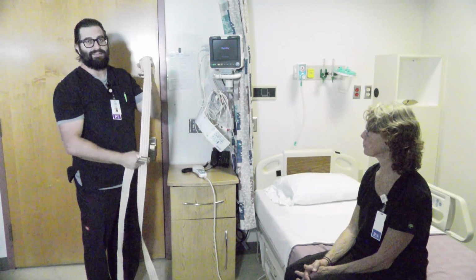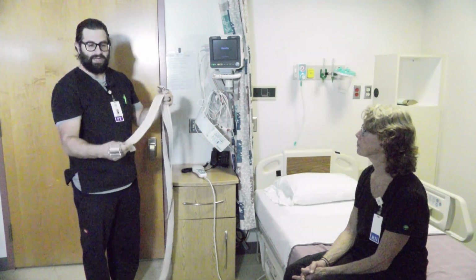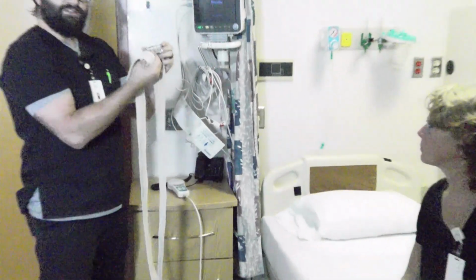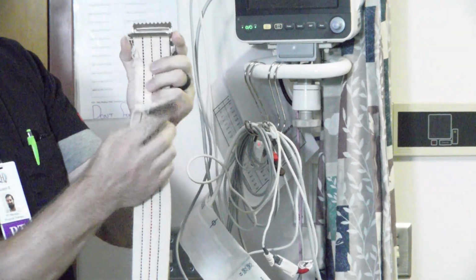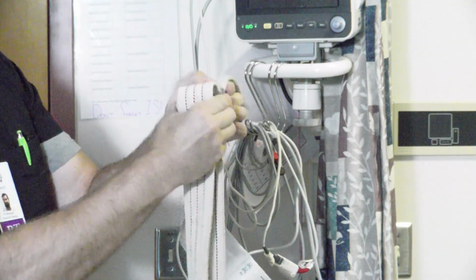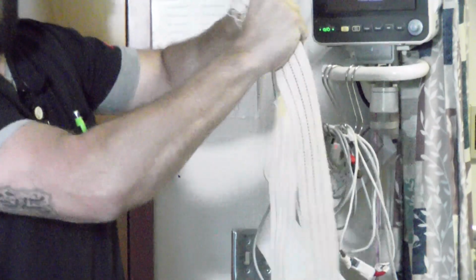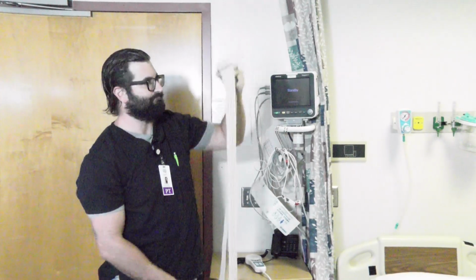But if you don't have access to that, you can use two different gait belts to make a bigger one. And so what it looks like is this. You see the T side of the belt, okay? You simply take the opposite belt and you stick it through and then through the hinge part of the belt. Okay, and that creates a very strong, tight pull. I cannot pull that out, okay? And then you have your other two openings to work with to put it around an individual.